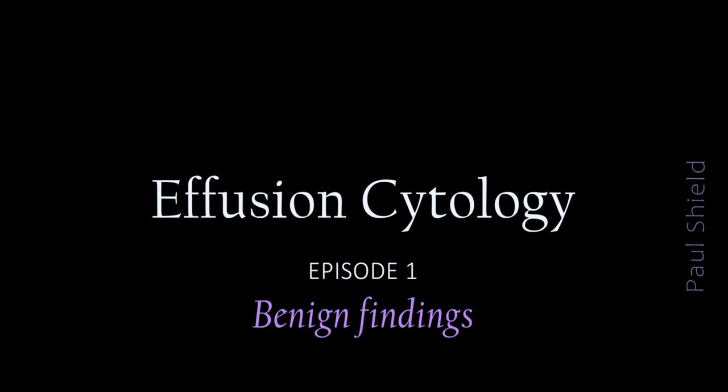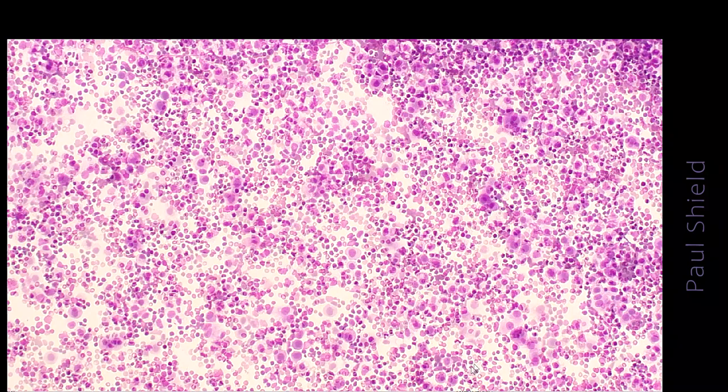Hi, it's Paul. Let's check out normal serous effusion specimens. Now I'm going to concentrate on the morphology of mesothelial cells because that's the key, really, I think, to diagnosing fluids. Here is a normal fluid specimen.